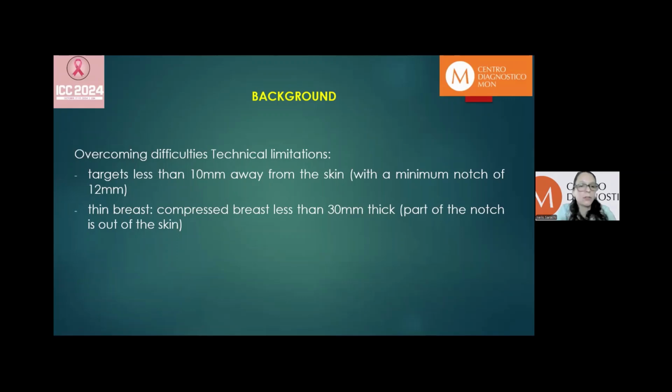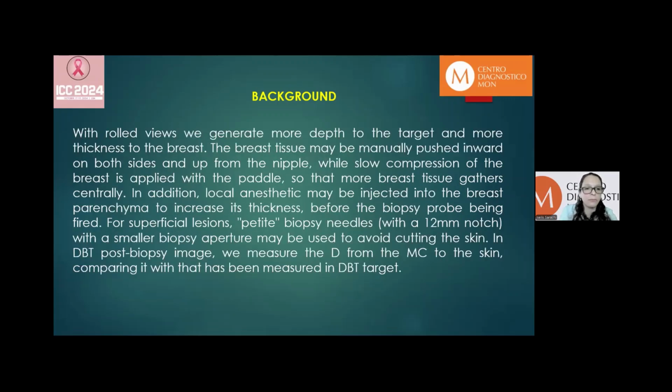Other difficulties to overcome are targets less than 10 millimeters away from the skin, with a minimum notch of 12 millimeters, and thin breast, compressed breast less than 30 millimeters thick. Part of the notch is out of the skin. With roll views, we generate more depth to the target and more thickness to the breast.